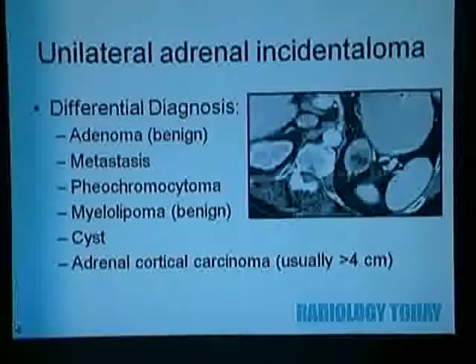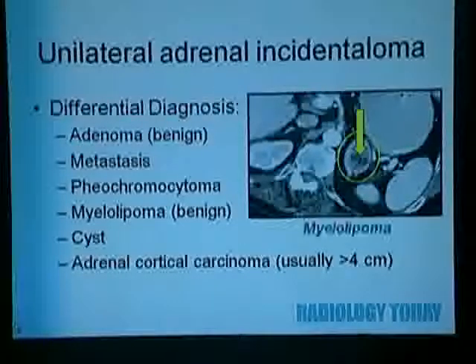Differential diagnosis is quite broad, including some benign as well as malignant etiologies. In the picture here is a case of an incidental adrenal mass. You can see that inside that adrenal mass there is fat density. This CT was acquired for reasons unrelated to this, and that fat density is the same as the perinephric fat. Fat density containing adrenal mass is, by definition, a myelolipoma. This was benign. No further workup was needed.